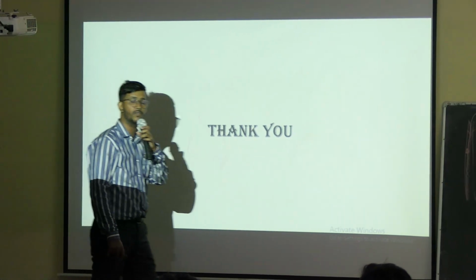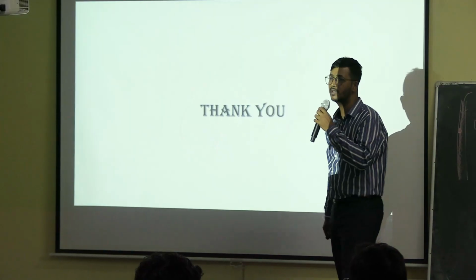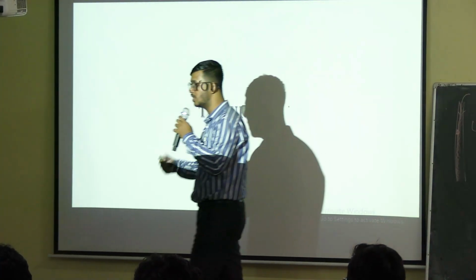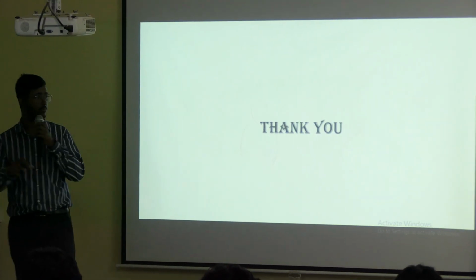So that's all from radiology of the abdomen. But basically, what you will be asked is just to identify whether a picture is a pathological condition or a normal condition.